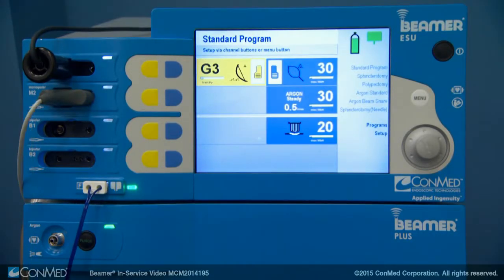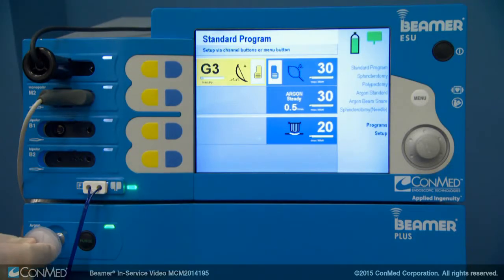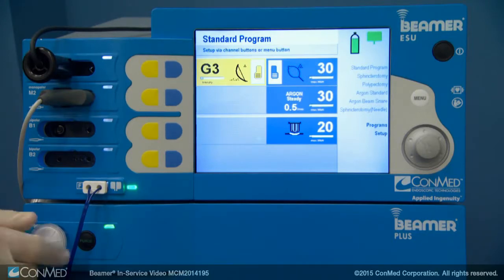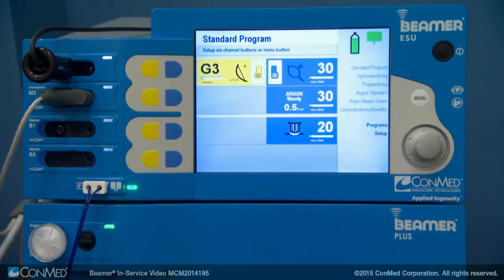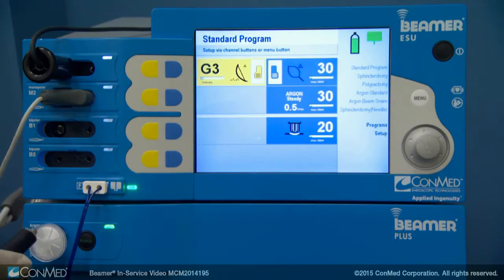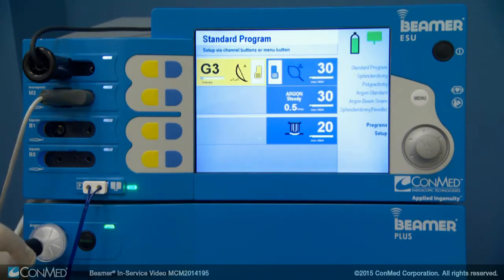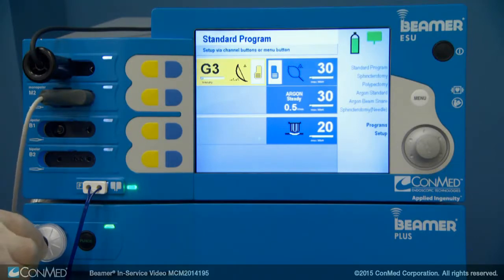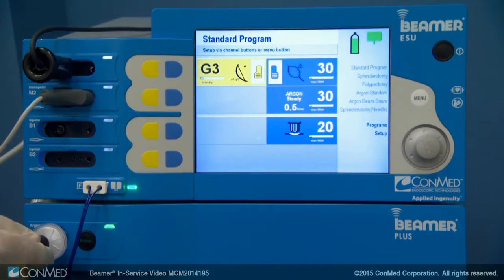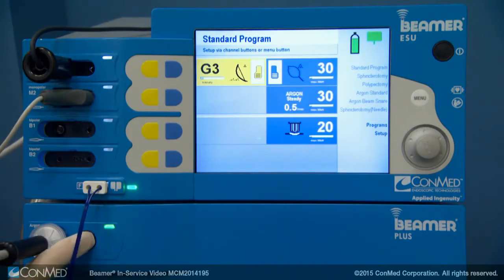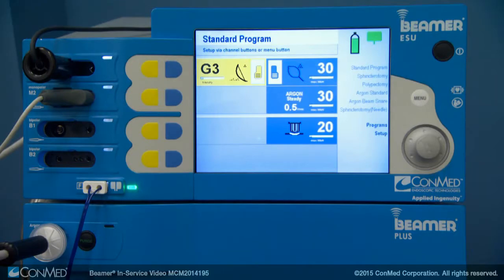Packaged with the probes are a supply of disposable filters. Attach the female end of a filter to the argon gas outlet snugly, being careful not to over-tighten, and then attach the reusable cable to the filter. Before placing the probe into the scope, press the purge button and gas will flow to purge the probe of ambient air. Now the procedure can begin.